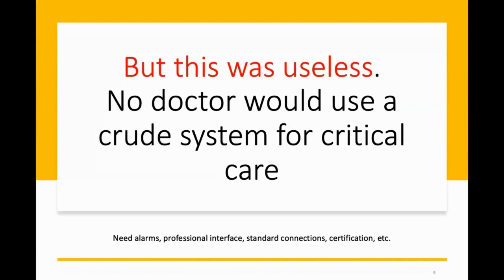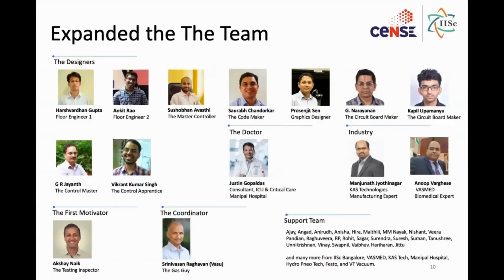In order to make this a ventilator that actually works, you need alarms, you need a professional interface, you need standard connections, you need certifications, you need to follow many rules. And for that, we actually had to expand the team. It was a learning process for us that, look, it's not just enough to build something that does positive and negative pressure. There were a lot of ventilators during those days using tires and this and that, and none of that ever made any sense in hindsight, but at that point it was pretty exciting.